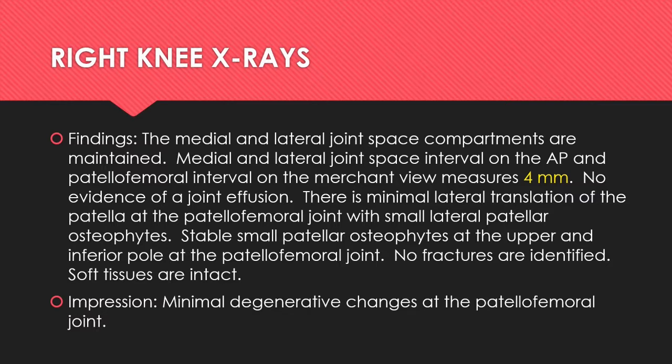And because Chapter 17 requires the assessment of post-traumatic arthritis in all lower extremity cases, whether the injury involved the hip, the knee, the ankle, or even the joints of the foot, post-traumatic arthritis is one of the impairments that examinees can suffer after a traumatic injury. And because this examinee did suffer a traumatic injury to the knee, the qualified medical evaluator rightly ordered the diagnostic x-rays of the knee. And here are the findings as described by the medical radiologist.